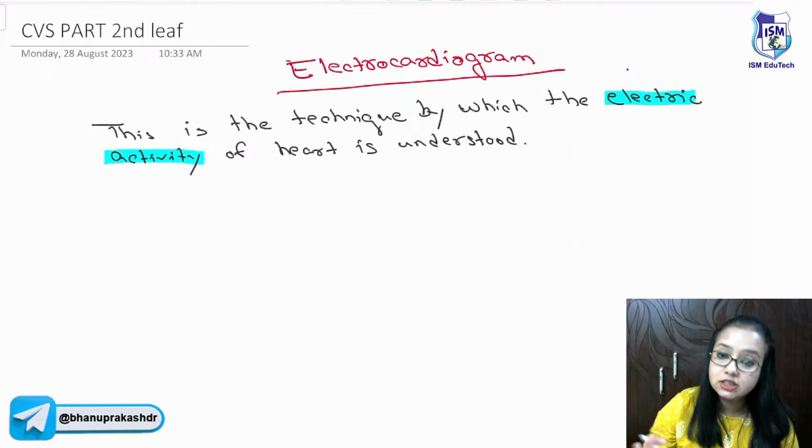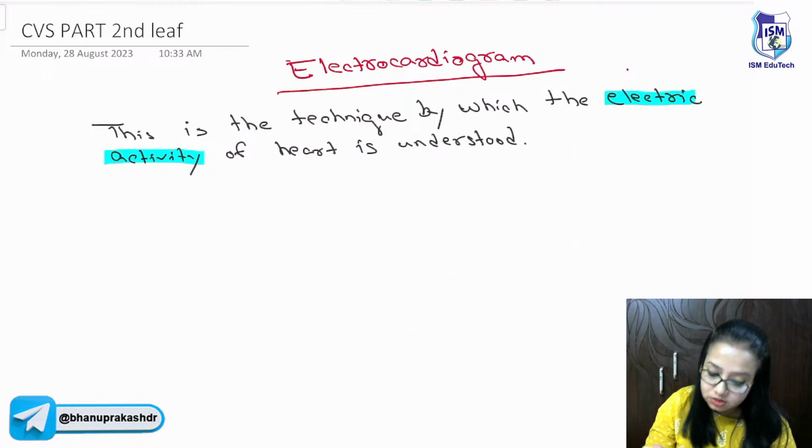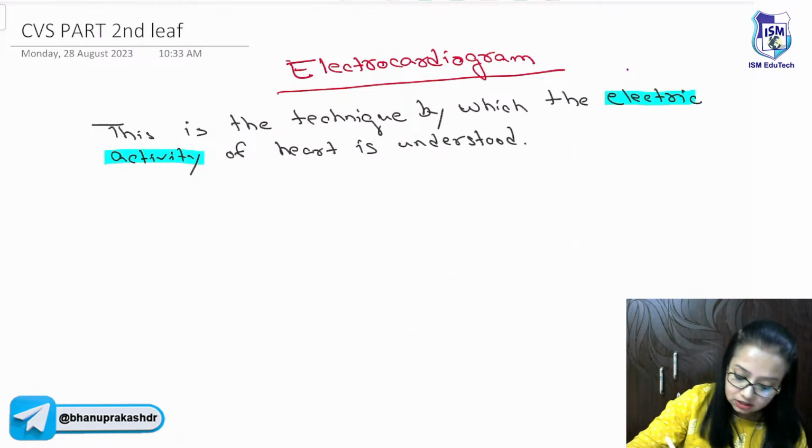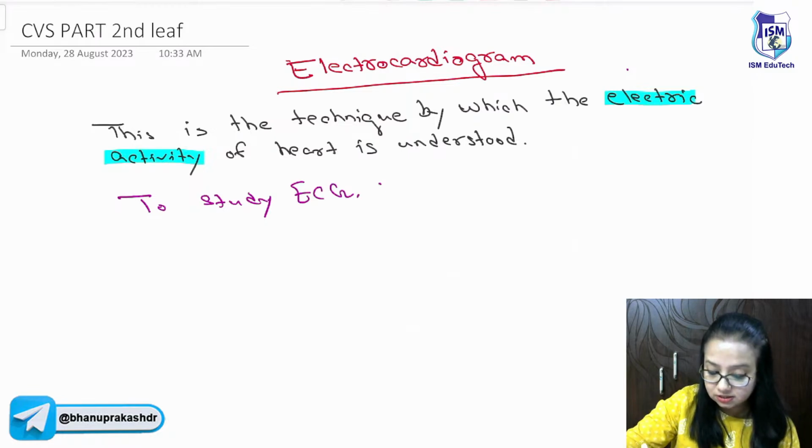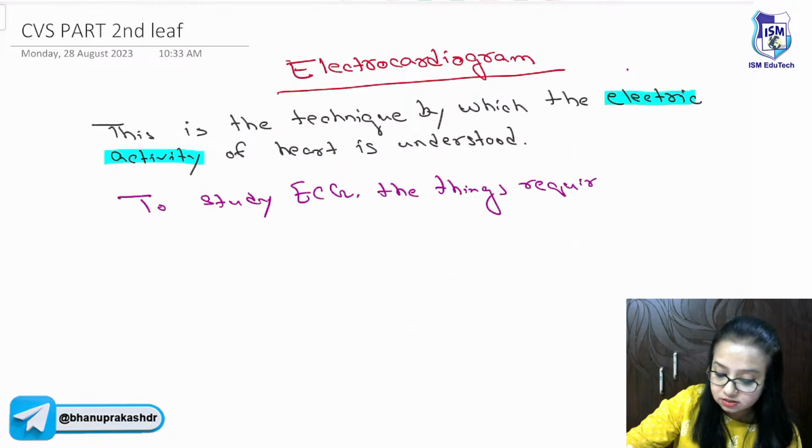Now, there needs to be a setup to study the ECG. To study ECG, the things required, because it is an electric activity study.